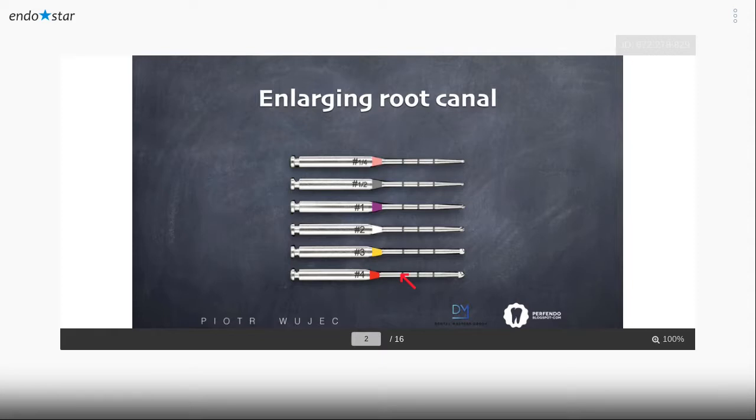They are my favorite rotary burrs, and this one is my loved one, because the size of the head of this carbide burr is, according to ISO standardization, size 40, and this shaft is 34 millimeters long. So under the microscope, we can deeply prepare the canal inside with a huge precision because of the small head of the file.